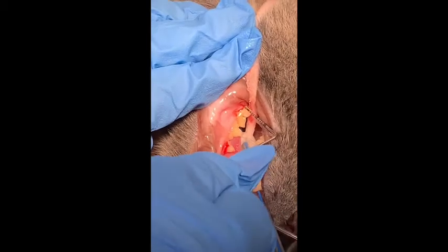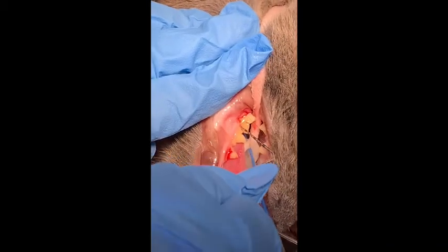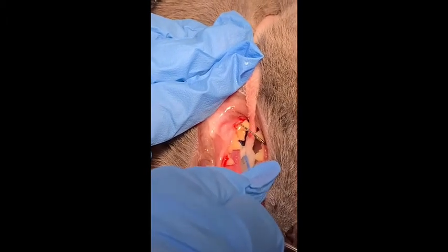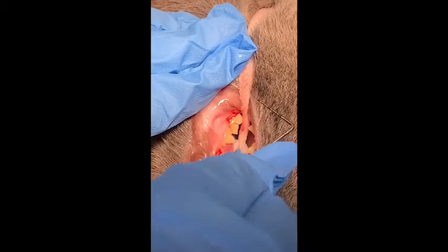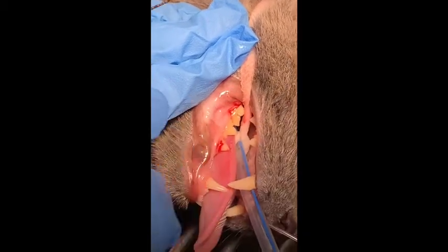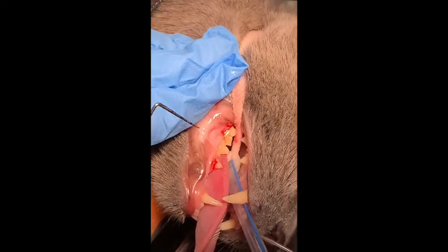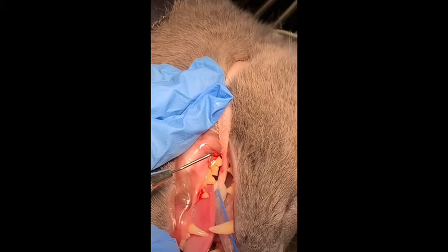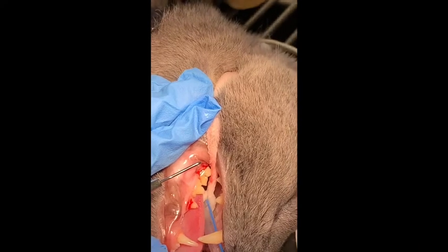So again, going around that tooth and measuring that, probably depth of 0.5, and then for recession, you want to change the probe, and then go along and probe that, and that's checking for furcation.